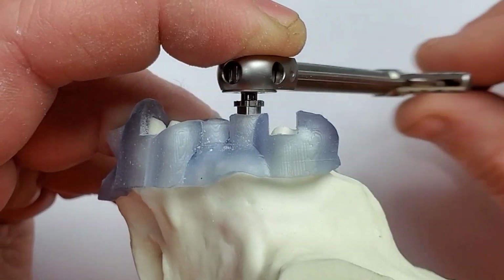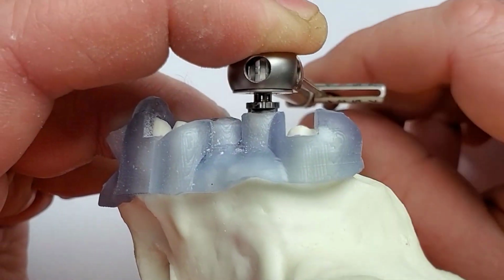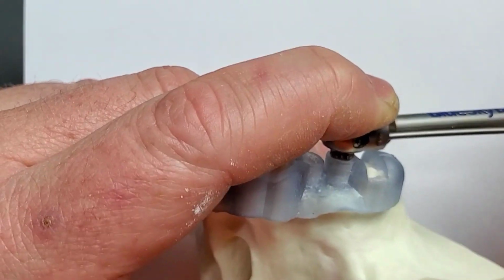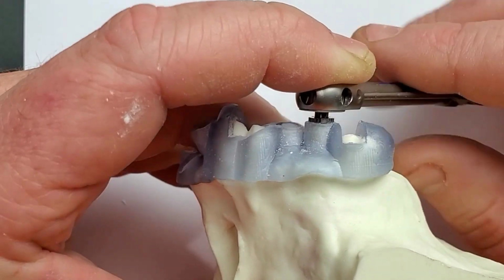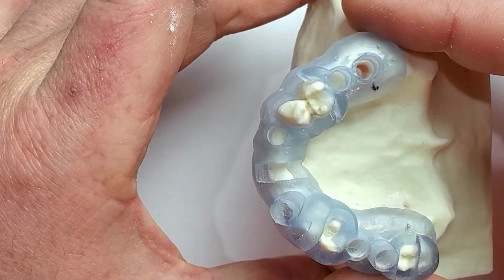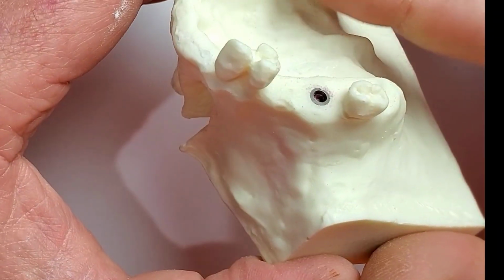So as I begin tightening this implant in, I'm watching very carefully to see when that stopper on the carrier bottoms out on the guide tube. It's critical when using this kit that once that stopper hits, you gotta quit cranking it. Because if you don't, then what happens is that the implant can't go any deeper, but you're still spinning it in a circle, and that will cost you all your primary stability. You've essentially turned that implant into an auger now instead of continuing to place it deeper. So that would complete the procedure. If I remove the guide now, you can see the implant in place, exactly where it should be.